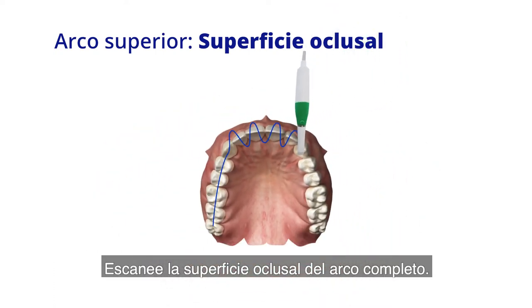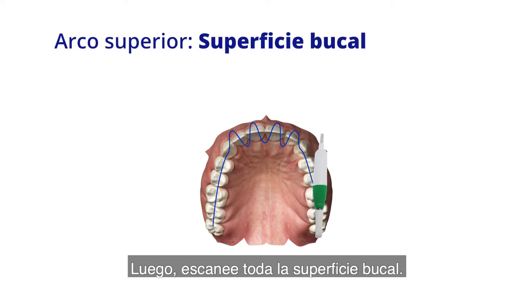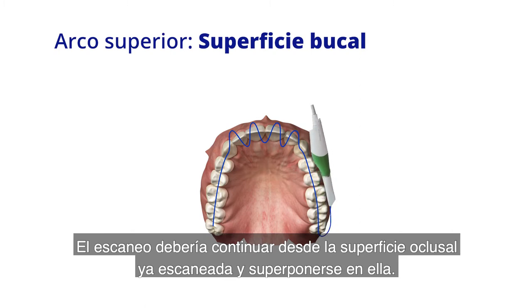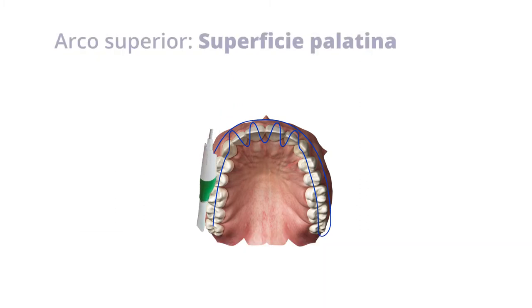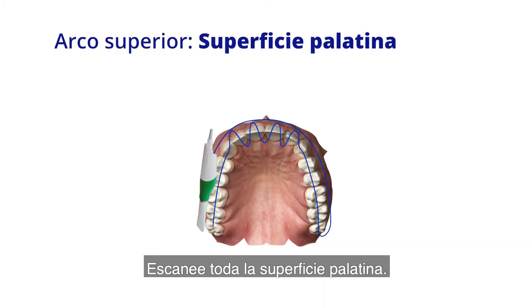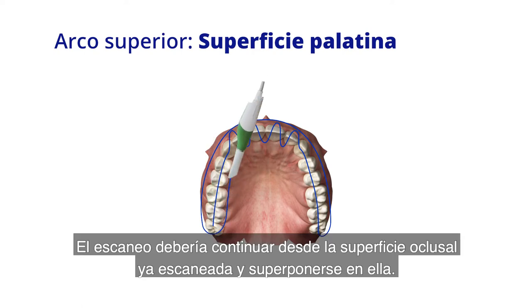Scan the occlusal surface of the entire arch. Next, scan all of the buccal — the scan should continue from the occlusal surface already scanned and overlap with it. Then scan all of the palatal, again continuing from the occlusal surface already scanned and overlapping with it.